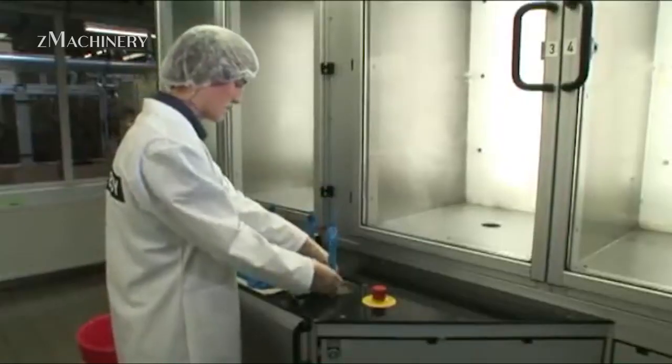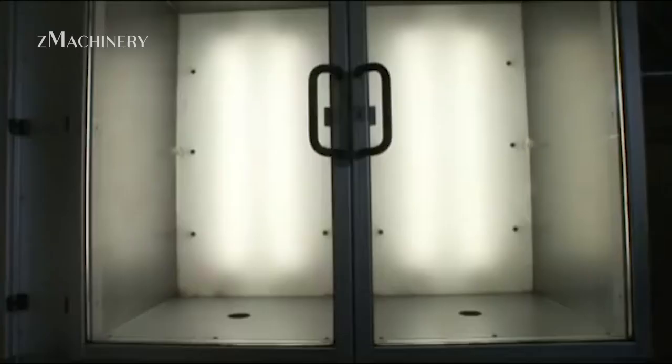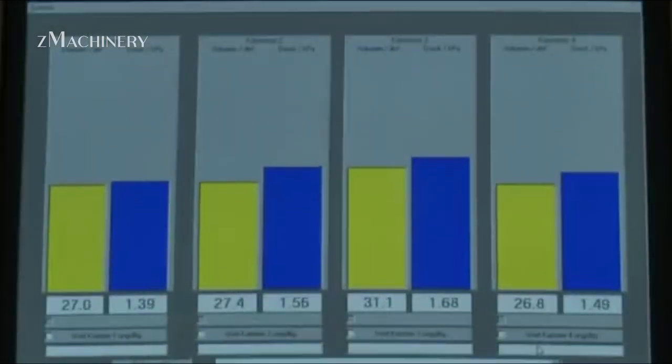Condoms are randomly selected and tested for strength, elasticity, and most importantly, holes. One common method is the electronic pinhole test, where a condom is stretched over an electrified probe. If there's even a microscopic defect, the circuit completes and the condom is rejected.